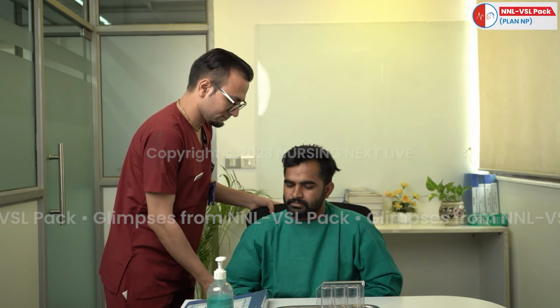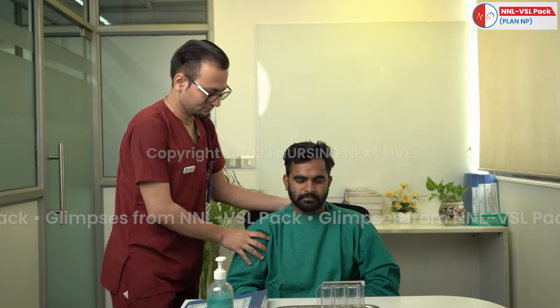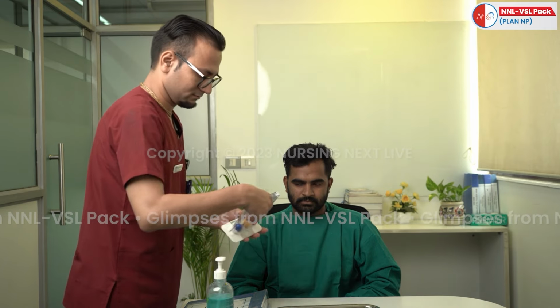Provide relaxed and comfortable position to the patient. Example, sitting upright in a chair or side lying if extra volume is required in one lung due to ventilation perfusion matching. Give incentive spirometry to patient.